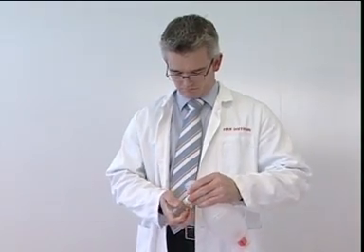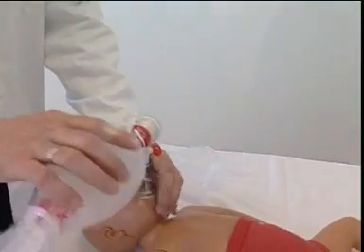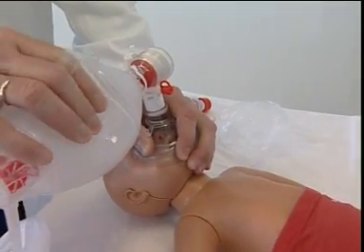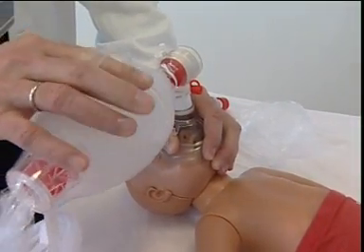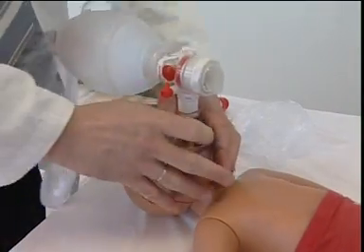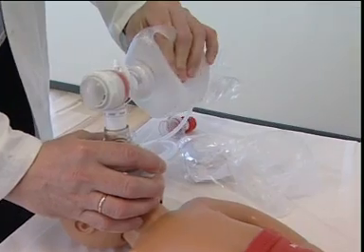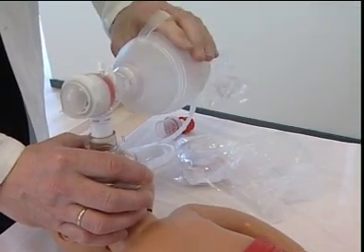When the SPUR II has been prepared and tested ready for use, it can be used for ventilating the patient. Hold the mask with one hand so that it covers the patient's nose and mouth, and start ventilating with the other hand. By using the swivel attached to the patient valve, the SPUR II can be placed in a 360-degree angle in relation to the patient.